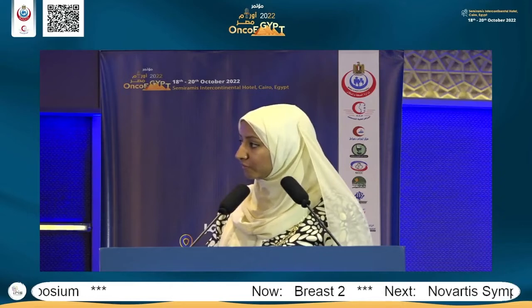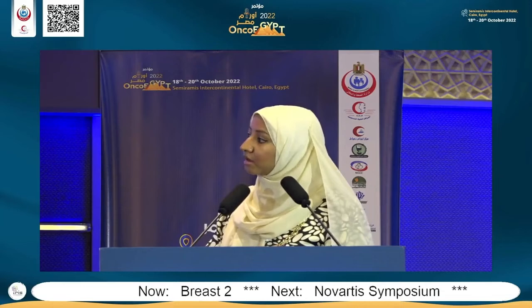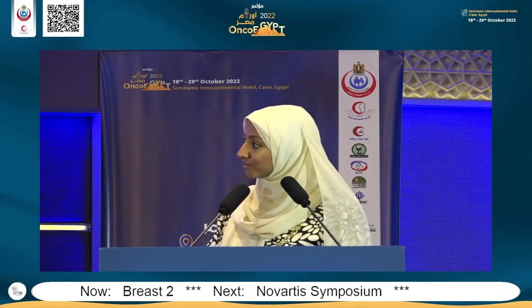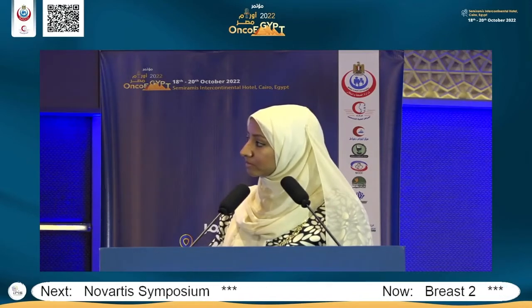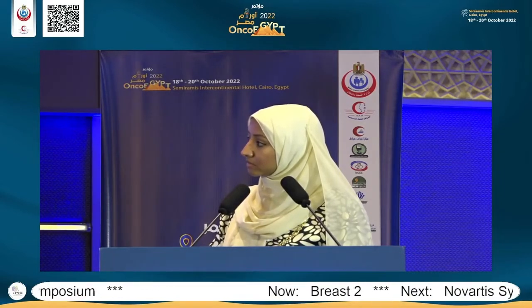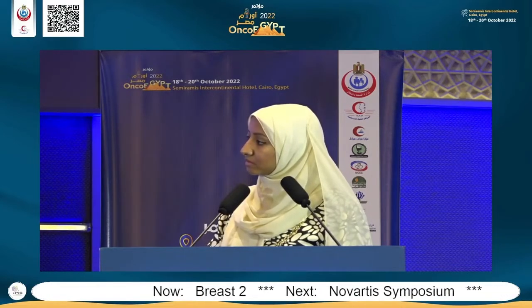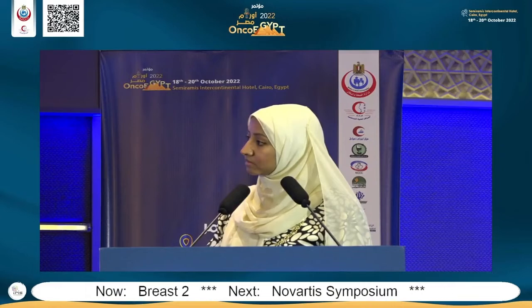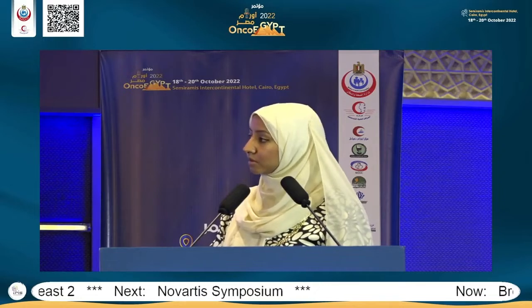ده كانت الفكرة ماي بس زي بوينت. ما حضرتك قلت إن الMRI مش available في كل الأماكن، طبعًا الcost بتاعته عالية، والtiming طبعًا والافيلابيلتي، وقت الاكزامينيشن اكتر. بالضبط. انتوا ممكن تشتغلوا على تفاليديت اللي حضرتك شفتيه بعد الكيموثيرابي على الريزلت اوف باثولوجي، بالظبط. ويبقى عند حضرتك بري كيموثيرابي الماموجرافي اهو، بوست كيموثيرابي الماموجرافي اهو، الباثولوجي اهو. ان احنا نقدر نوصل زي نوموجرام او زي بريدكشن موديل، شكل المورفولوجي بعد الكيمو هيبقى عامل ازاي، وبعدين اكوريليت يتطابق مع الباثولوجيكال ريسبونس. أوكي، تمام.